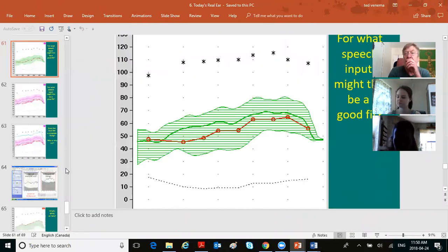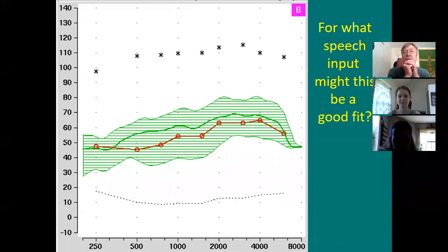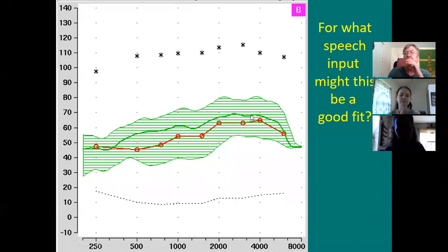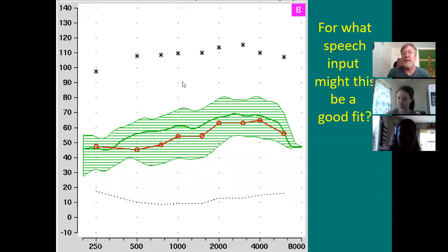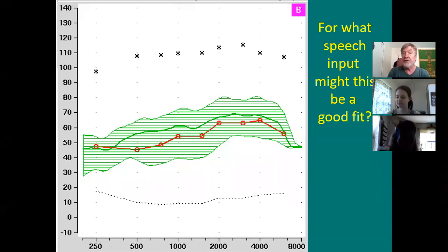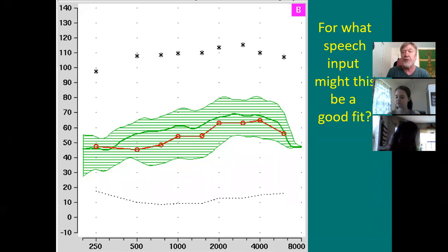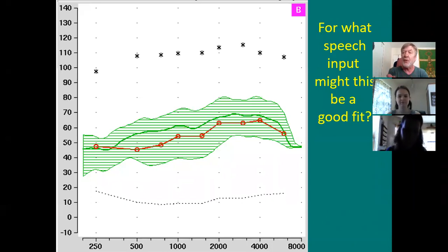For what speech input might this be a good fit? You can see the green is sitting here. For soft, average, or loud? Soft — good. Look at where the green is; it's all hugging the thresholds. The mean is barely above the thresholds. That's what you want for soft inputs — your targets should be kind of marginal. Because if soft speech is barely audible to someone with normal hearing, why should it be any different for someone with hearing loss? You want to aid soft speech so it's barely audible, so you can visually see what the client is hearing.